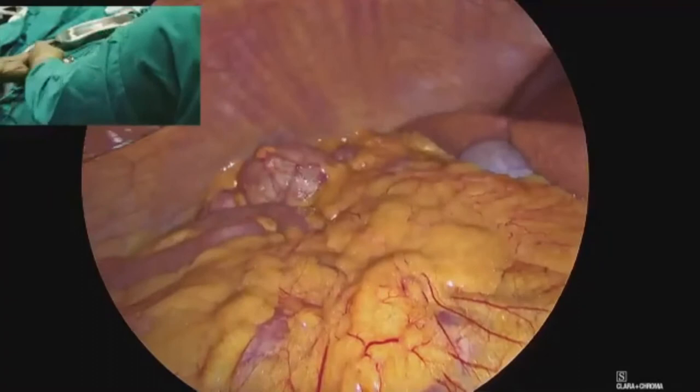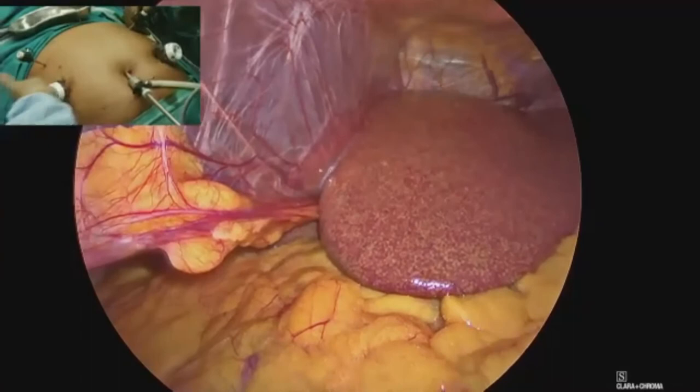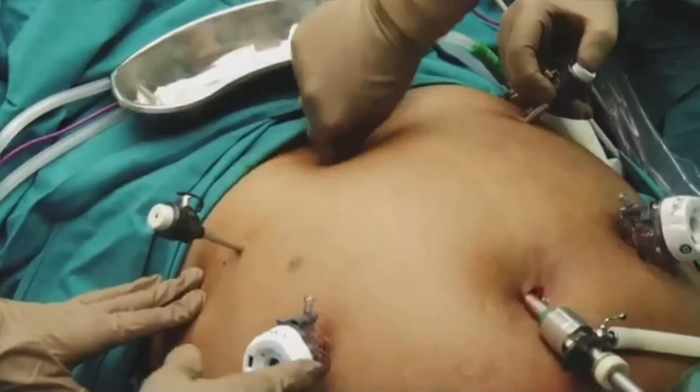So the ports are in. As you can see in the PIP, we have around four ports. Two ports, 12 mm, on the left side in the mid-clavicular line, on the right side again the mid-clavicular line, two finger breadths above the optical port. And we are ready to perform the procedure.